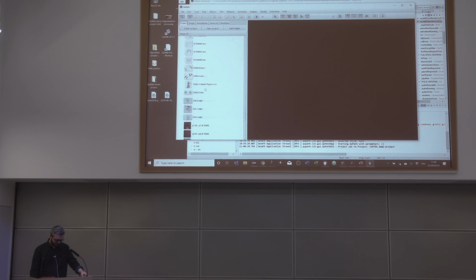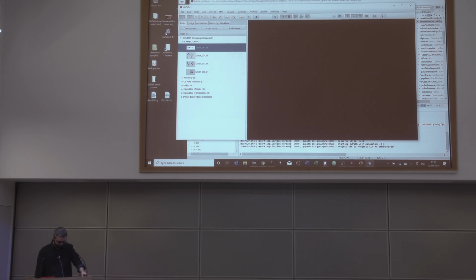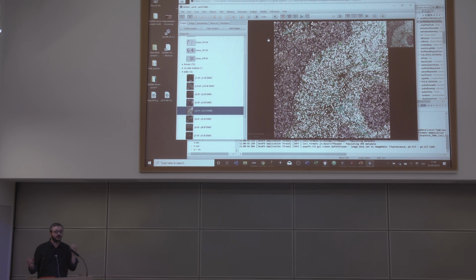When you detect the cells, initially you are segmenting the boundary of the cells. The nuclei, yeah. As I saw a little bit, the boundary is bigger than the cell area. So how reliable are the features you extract from this, especially the shape features? Do you mean of the nucleus or of the entire cell whenever it's expanded out? The entire cell? I would say not reliable, and that's why multiplex analysis is one of the things I really want to work on, because I think that's a big issue.